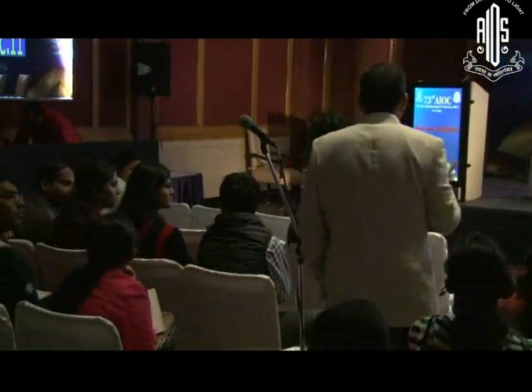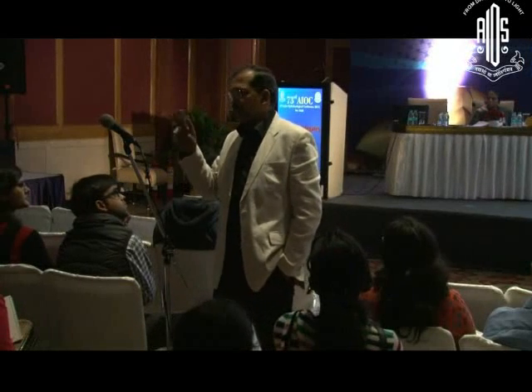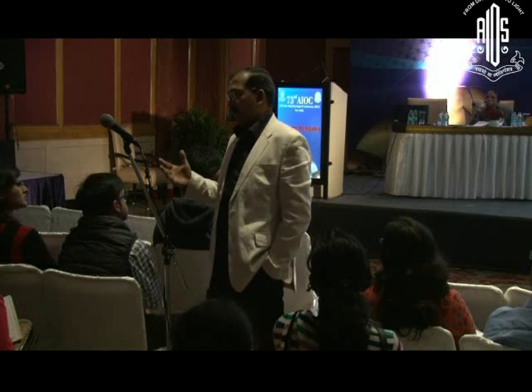See, again there are two issues here. It all depends on how much you read ophthalmology. You can complicate the answer also. If you know too much ophthalmology, you can say there are two issues to consider here. Number one, what biometry you have done: whether I've used an optical coherence biometry, like an IOL Master or a Lenstar, which takes the silicone oil into consideration, or a normal routine ultrasound biometry.